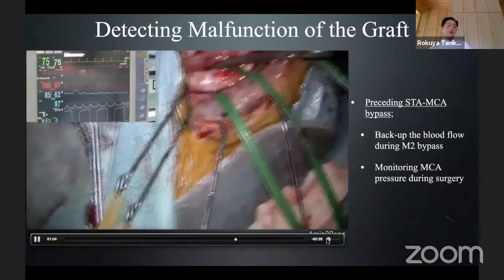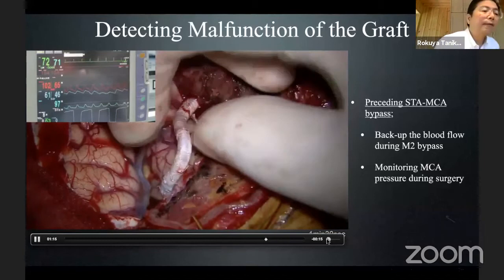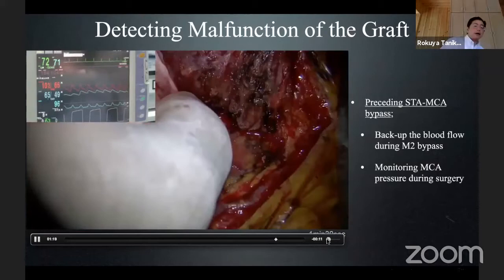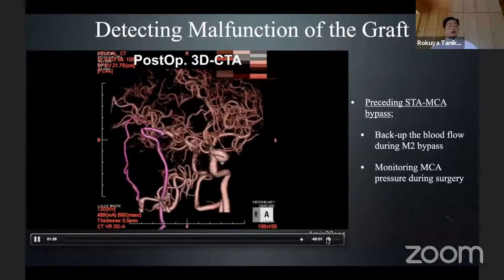Now the graft is corrected and the twist is removed. Again MCA pressure monitoring: the 73 mmHg control pressure declined to 42, and it immediately recovered to 50–60 mmHg after opening the high-flow bypass. The monitoring of whether the graft is working well or not is very important during surgery.